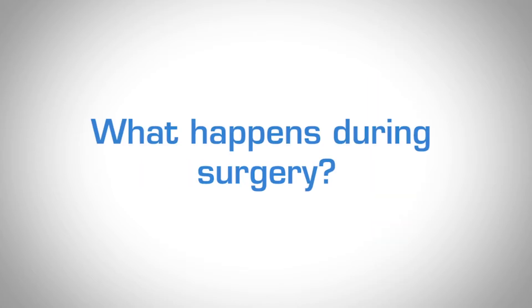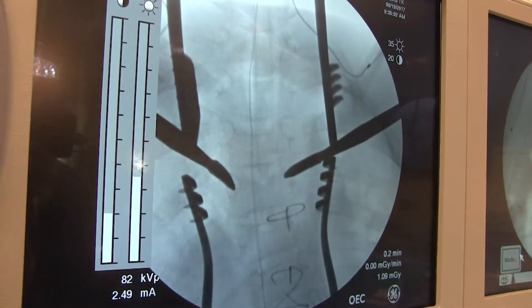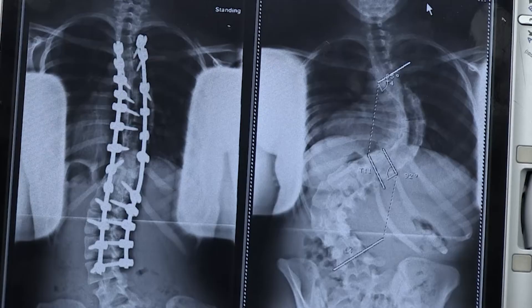We make an incision down your back. We use x-ray — fluoroscopy, very low dose — during surgery to help us with safety as we introduce the screws into your bone. Then the rods attached to that, we manipulate those around.